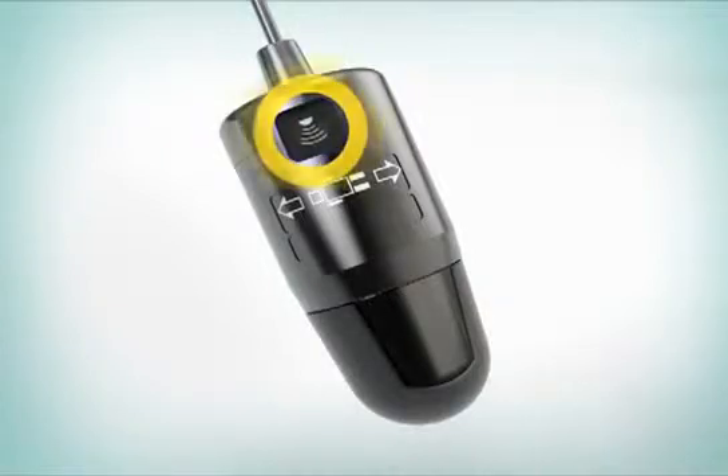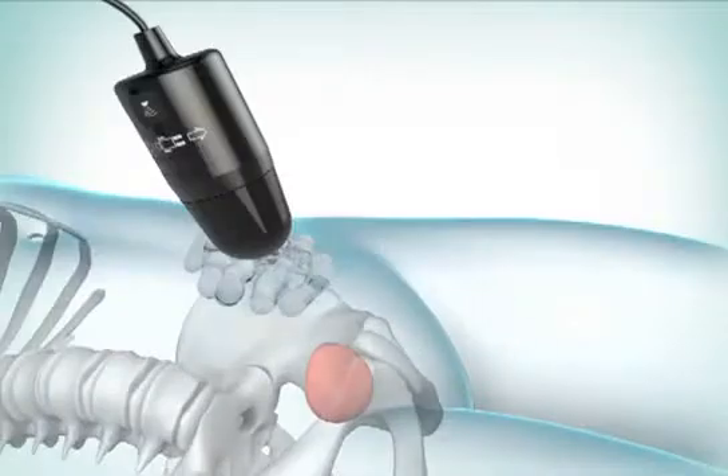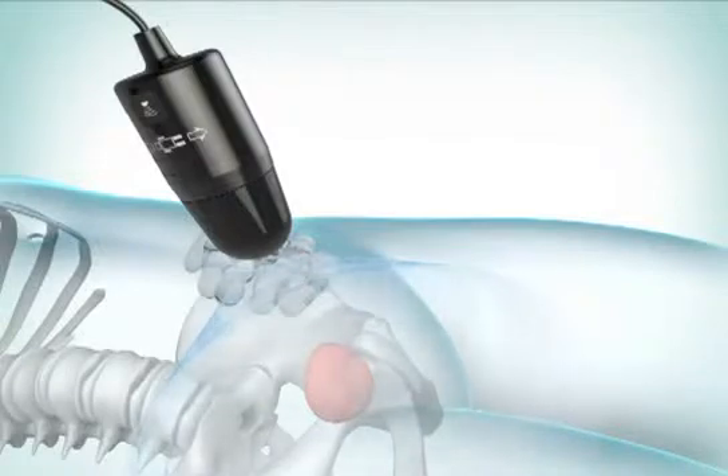Press and release the Scan button on the probe. Hold the probe steady during the scan. When you hear a beep, the scan is complete.